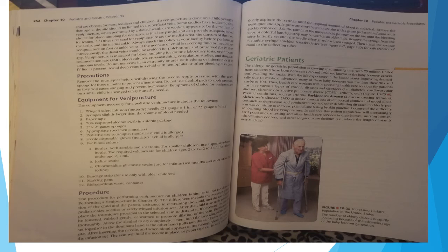Disinfect the site thoroughly. Allow the alcohol to dry completely. Then hold the two wings of the infusion set together in the dominant hand as the other hand pulls taut the skin below the puncture site. After inserting the needle and when blood appears in the tubing, release the wings of the infusion set. The skin will hold the needle in place, or tape can be used to secure it. Gently aspirate the syringe until the required amount of blood is collected.